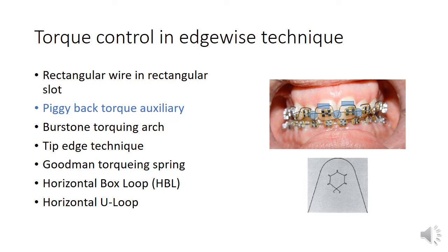To prevent increase of overjet due to labial crown torque of anterior teeth, the main arch wire should be cinched back tightly, and class 2 elastics are recommended to save the anchorage.